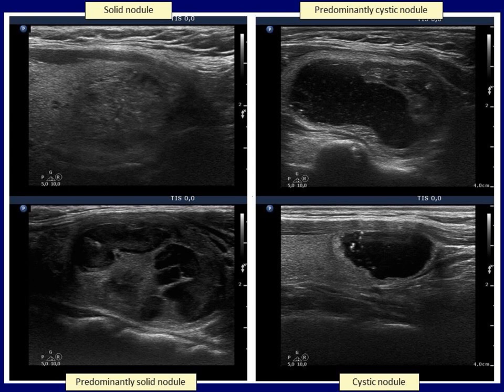This table refers to the basic terminology. Although the left upper nodule shows tiny cystic areas, the sum of these areas is surely below 5%, therefore this nodule should be classified as a solid nodule. In the left lower case, the solid parts exceed that of cystic areas; however the amount of the latter is above 10%, therefore this nodule should be considered as a predominantly solid nodule.